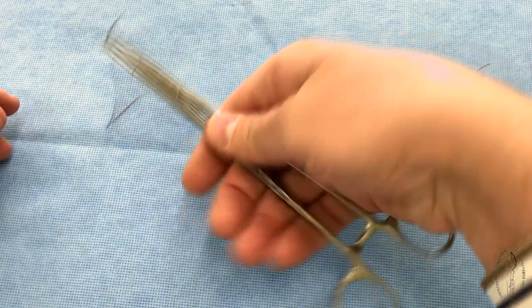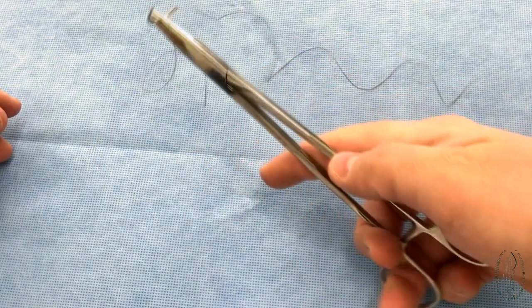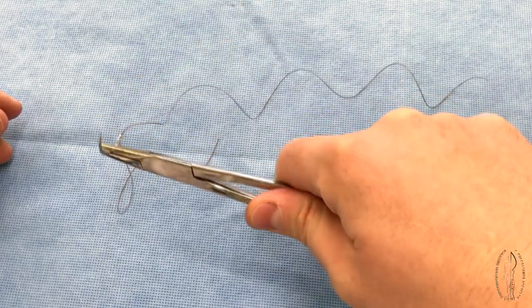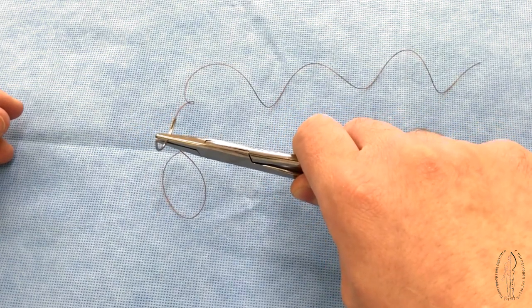There is an option of fixing the needle holder by arm span of the handles. In this case, it will be necessary to insert periodically the aforementioned fingers into the rings to open the tool lock.